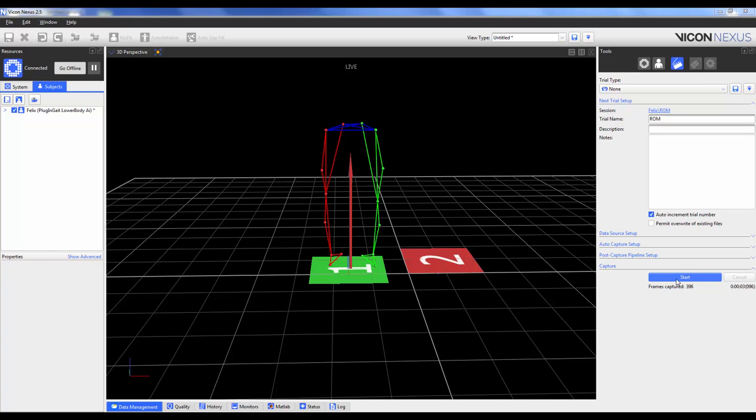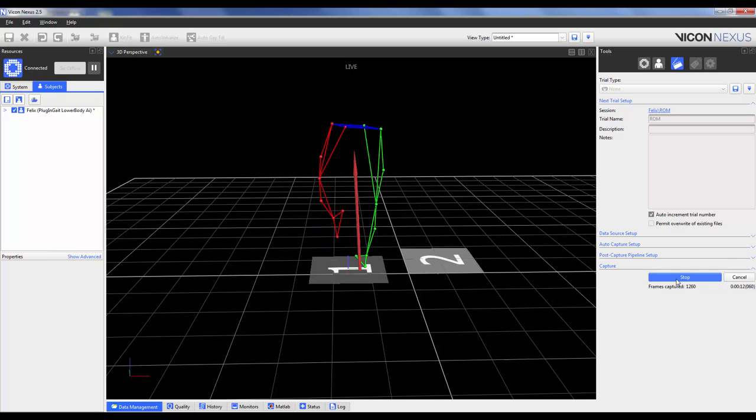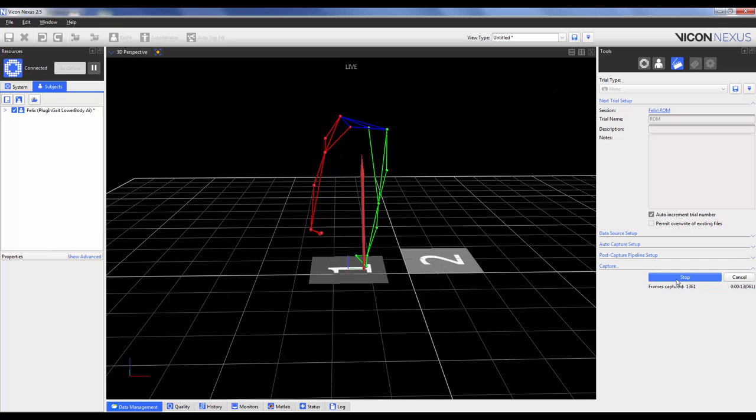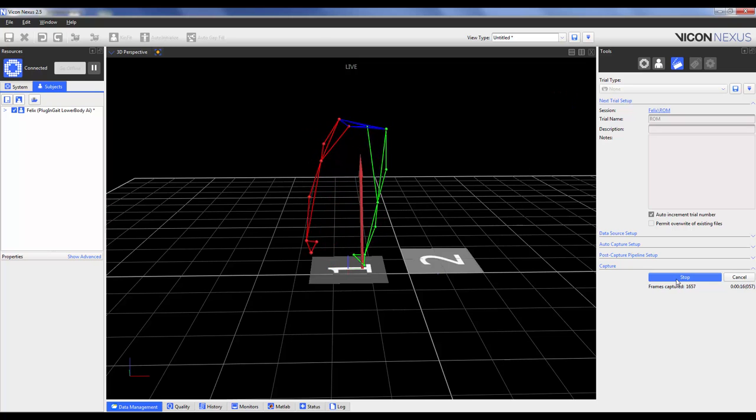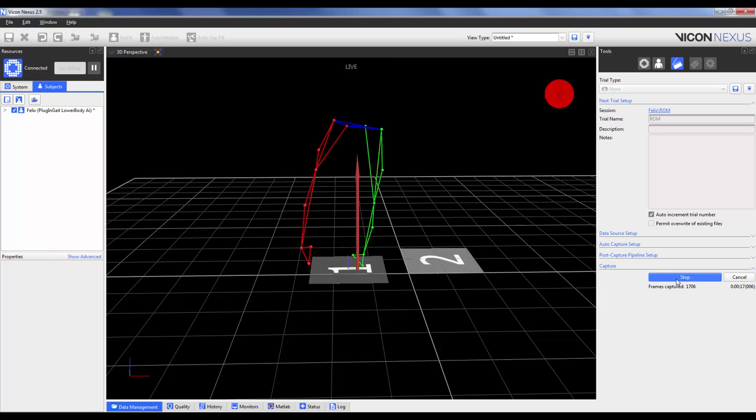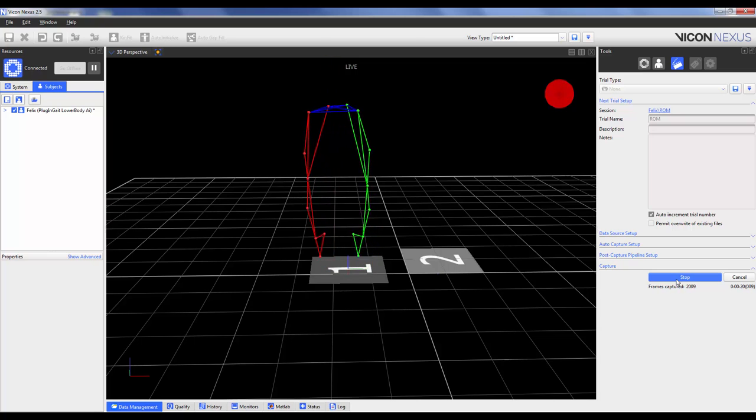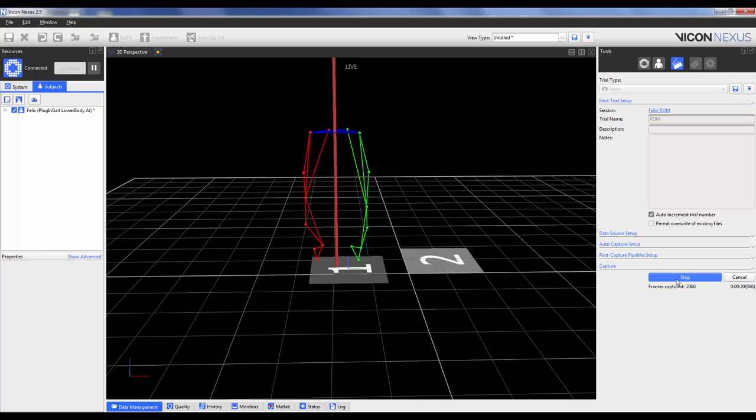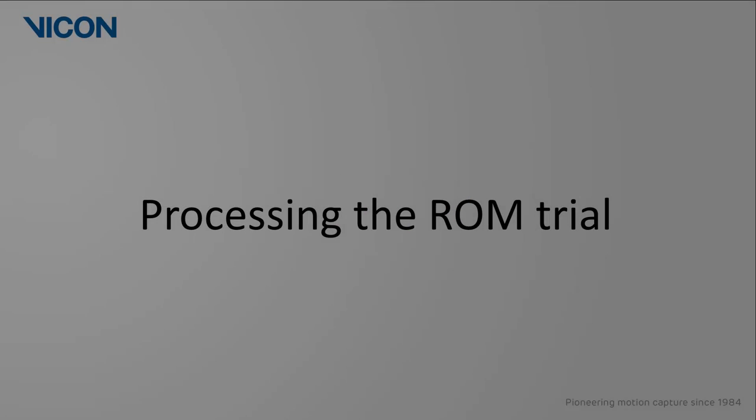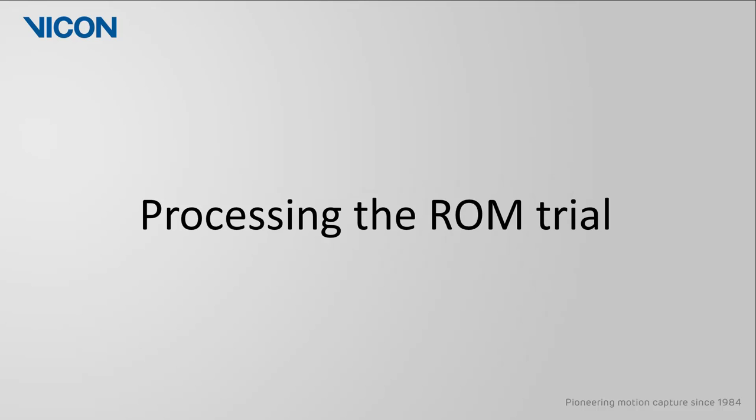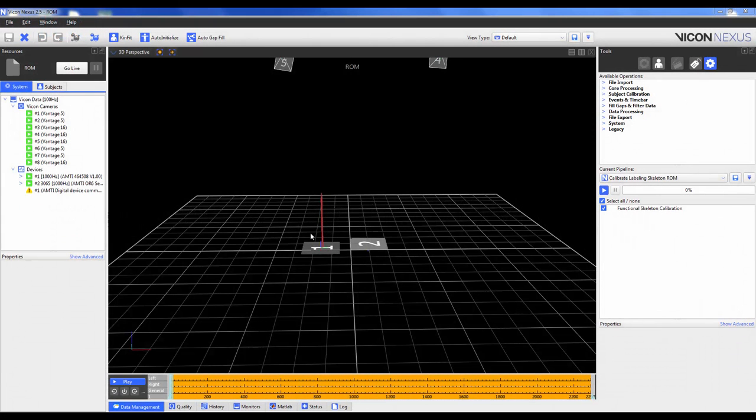As such, the physical movements performed by the subject in the ROM should at least mimic the joint ranges and velocities expected during the dynamic trials. While you could use a dynamic trial as the ROM, it is probably best that the subject can perform a series of movements in the middle of the capture volume that can meet the joint range and velocity requirements. For example, if we were analyzing a counter movement jump, the ROM may look like something like this. This time I will capture the trial in the data capture tab and add a note so that I know that it is my ROM trial. So we'll have the subject start in the motorbike, they will perform a star arc, they will then perform a knee flexion extension across the entire range, then some ankle circles, and then we'll go ahead and do a few hops.